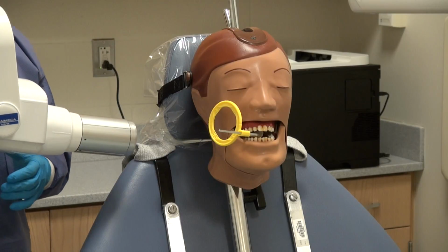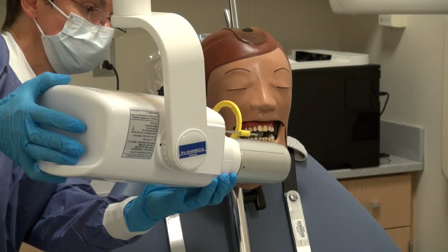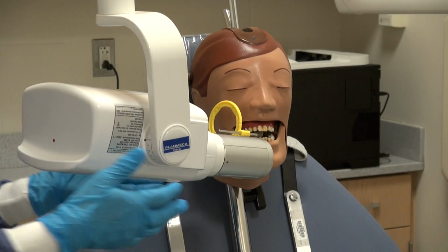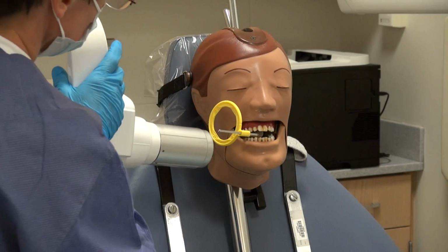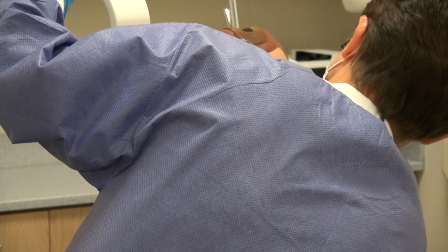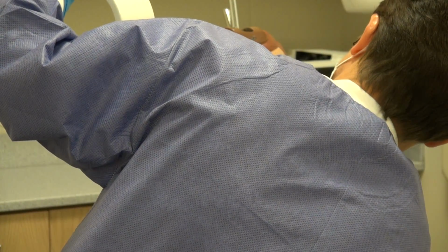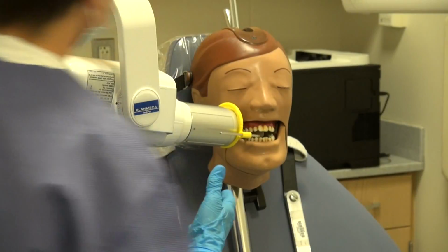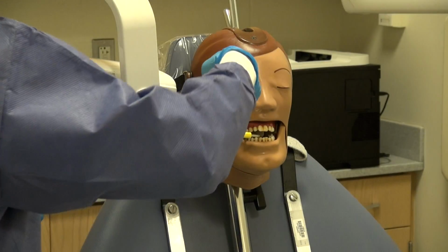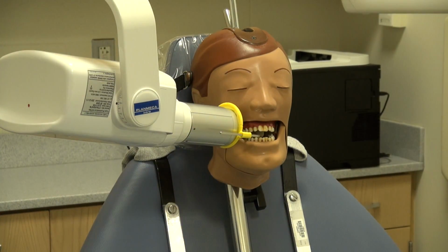Align the PID using vertical angulation, horizontal angulation, and bring to the ring. You can ask your patient to smile so that you can see where the film is relative to the teeth you are interested in. If there is a slight discrepancy between the PID and the ring, it's okay and should not be a reason to make the patient wait and readjust.